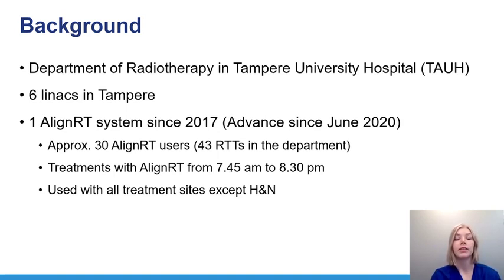And we feel that the more we use the system, the more comfortable and confident we are using it, because you need to get used to the system, as it's so different from tattoo-guided or positioned radiation therapy. And we started using the AlignRT Advanced 6.2 version in June 2020. And next, some words about it from our perspective.